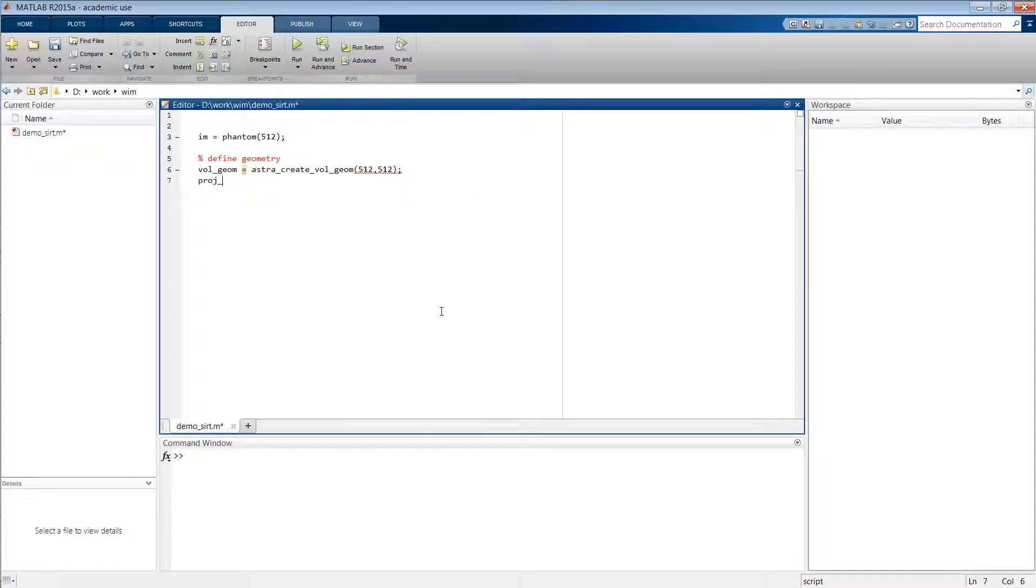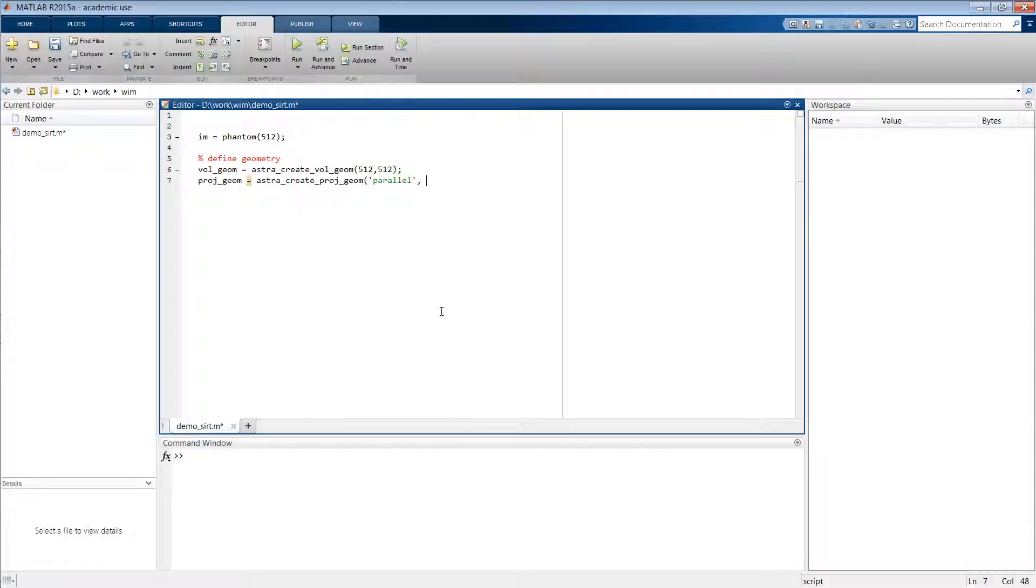The second type of geometry is the projection geometry, which we define by typing astra_create_proj_geom. In this case we want it to be a parallel beam projection geometry. We want the width of each detector to be one.